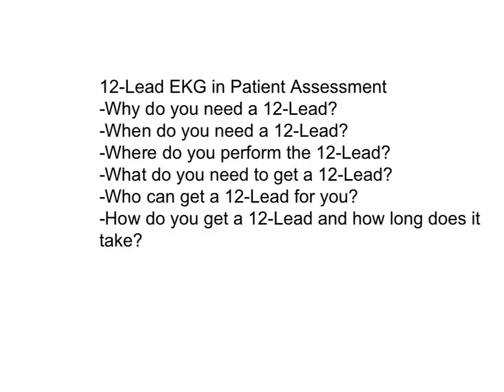The answer is that the limb leads don't provide you with a clear enough view and enough views. So you need the high definition view of the 12-lead where there's no filters, and if you see 1 millimeter of ST elevation, it really is there in 12-lead mode. In simple limb lead mode, it's not there. You can't rely on it being there.